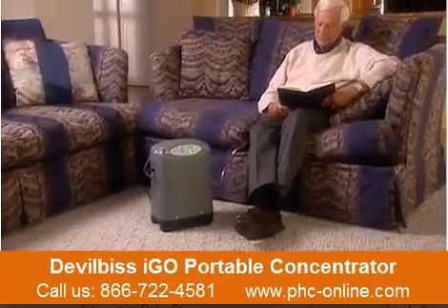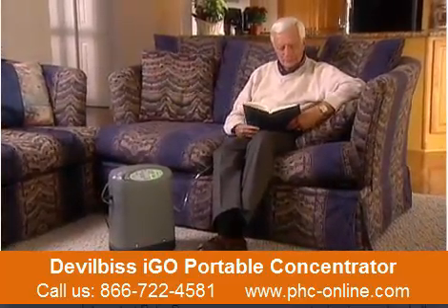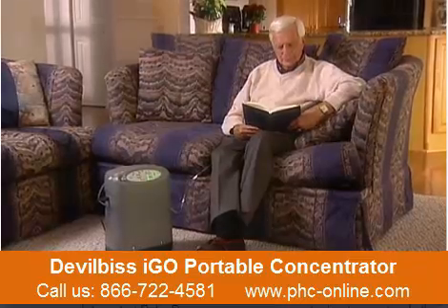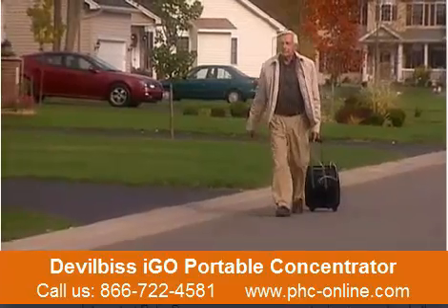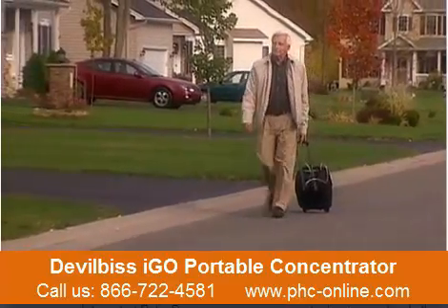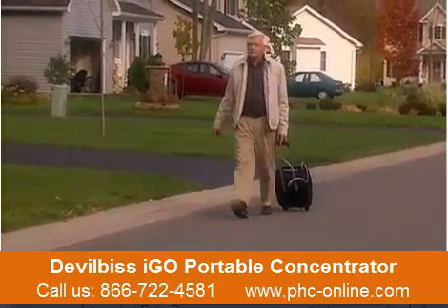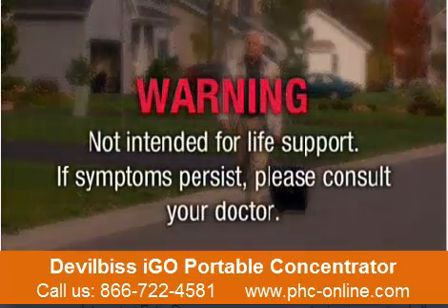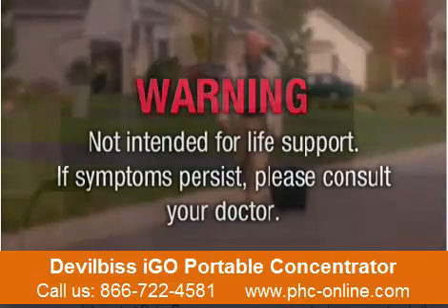Your doctor has prescribed the iGo system as a means to obtain supplemental oxygen for treating certain respiratory ailments. Depending on your condition, iGo therapy may improve certain symptoms such as headaches, drowsiness, confusion, fatigue, or increased irritability. The device is not intended for life support. If these symptoms persist after you begin your supplemental oxygen program, please consult your doctor.